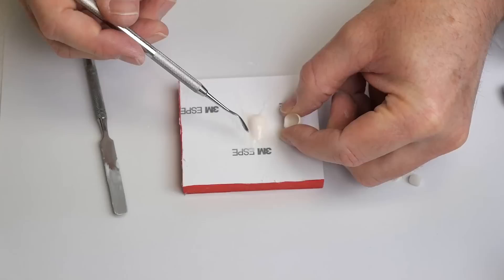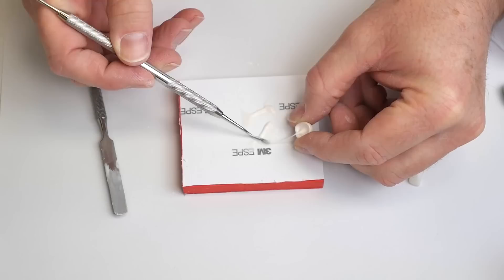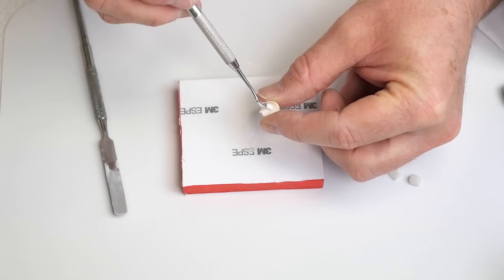Now we can grab our crown. As you notice, I'm using a plastic instrument here to load the crown — you don't have to; it's just a little easier for anteriors. My assistant does this much better than I do. You can use your spatula or finger; it doesn't really matter. Just make sure you fill it up to displace any blood or saliva, and there you go — your crown is ready to seat.